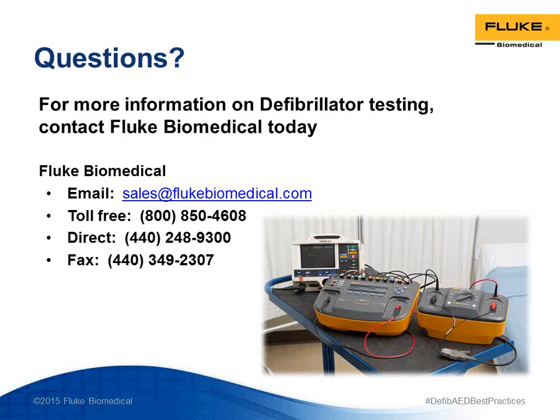Fantastic. Another question just came in. My tester is a standard 50 ohm. How do I test other loads? You cannot. You need other loads in order to perform the testing on those impedance sensing circuits. It cannot be done with just one load. So you really need to rethink the capability of the test equipment that you have in your hands right now.